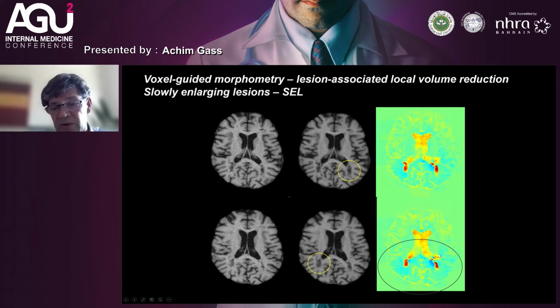This is demonstrating to you the effect of a focal lesion also on the brain parenchyma right next to it, because the connections are being cut and damaged by such an expanding lesion. And that makes it very obvious why such slowly evolving, increasing-in-size lesions have a bad impact on the clinical side.